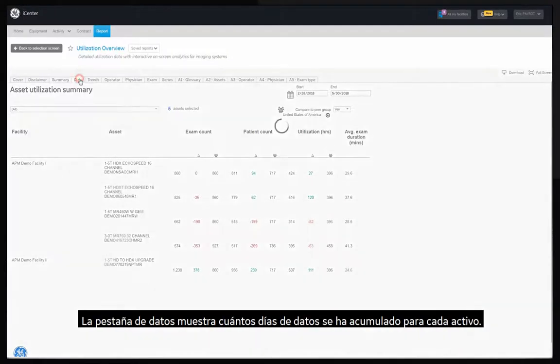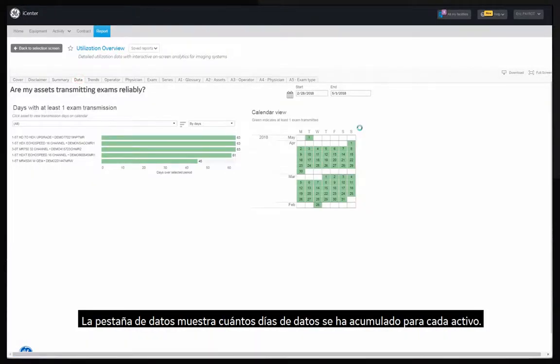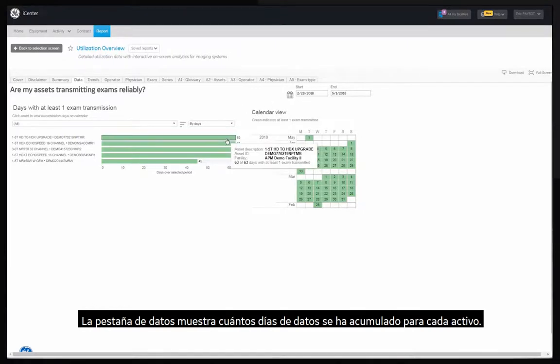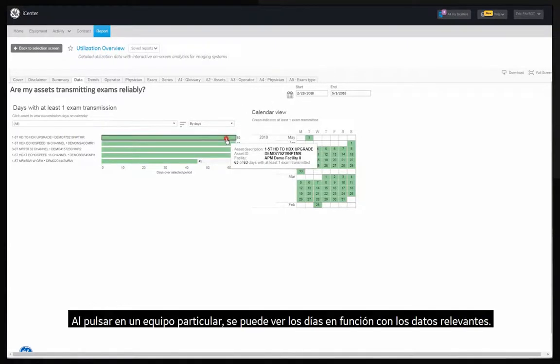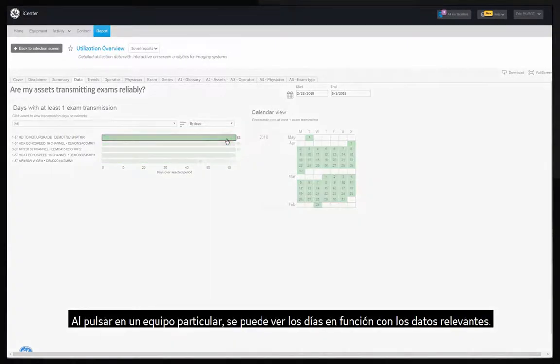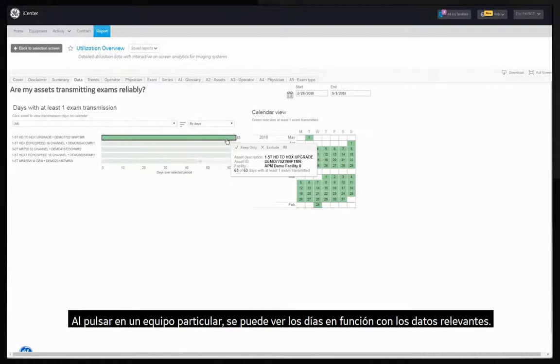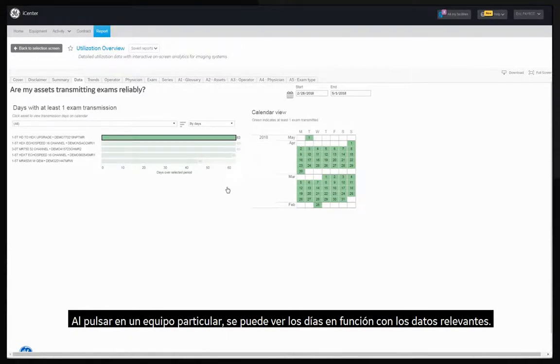The data tab shows how many days of data have been collected for each asset. By clicking on a specific equipment you can view the operating days with relevant data.